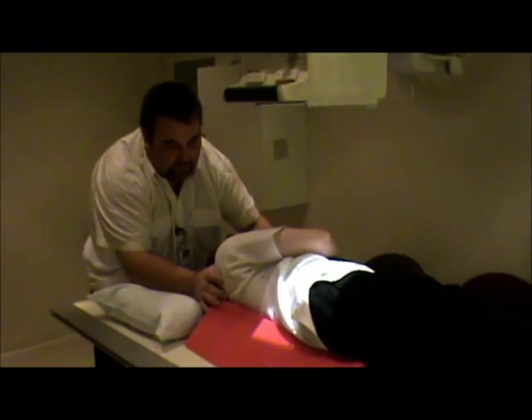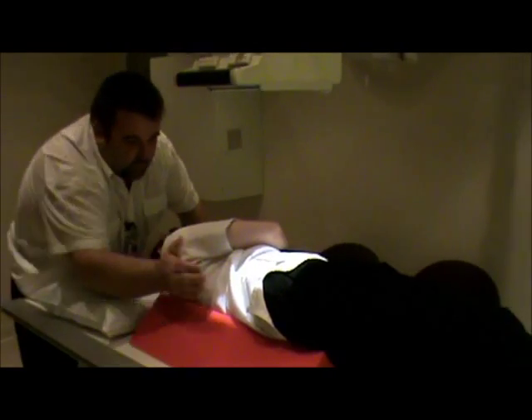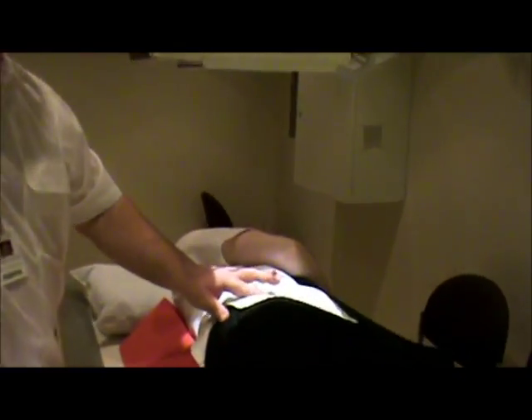I've got the patient at 25 to 30 degrees. I'm going to come to the top because I need to straighten her just a little bit — I want to get the shoulder and the hips in a straight line. Now I've got her oblique correctly. I'm going to palpate the ASIS again. Our centering for this is one inch medial to the upside ASIS. Collimation is going to be long and narrow, because we're just looking at the upside SI joint.